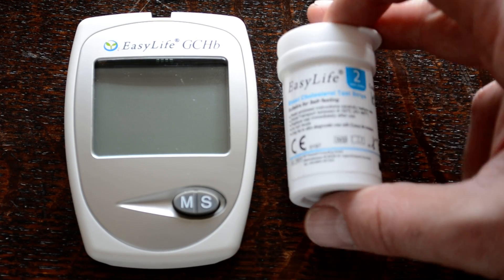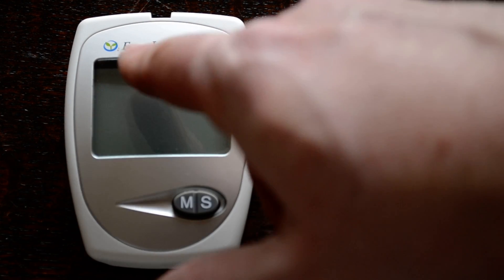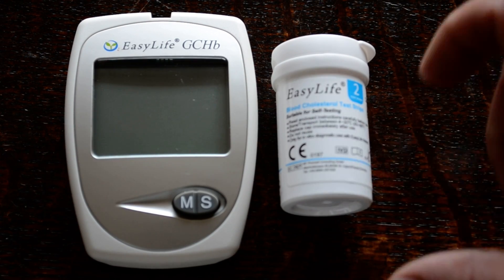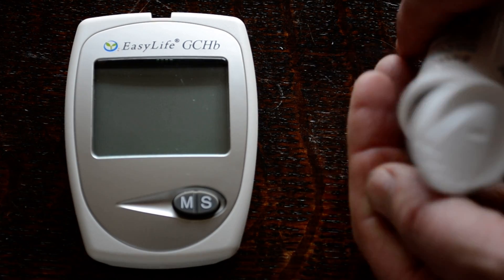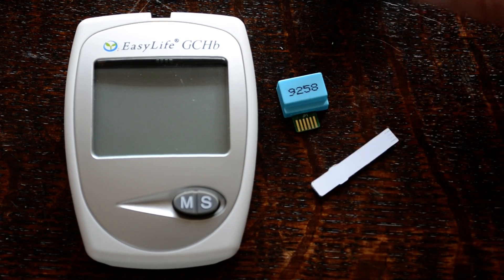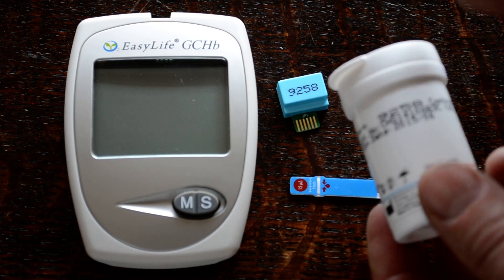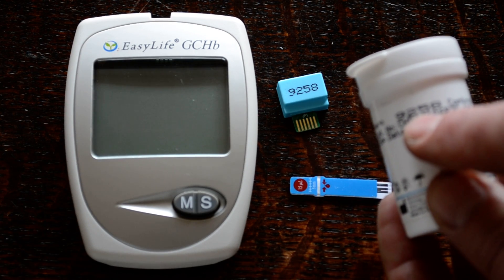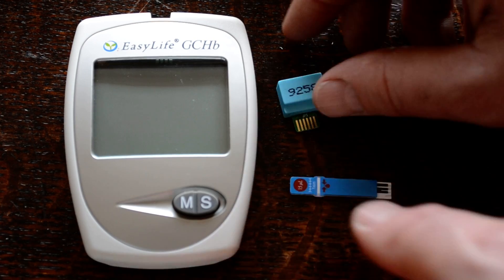When you buy one of these meters you get a starter pack of test strips — Easy Life cholesterol test strips for the Easy Life meter. You get two supplied with the meter. What you get is a code chip and the test strips. The code chip has a four-digit reference number — 9258 in this case — and I want to show you what happens when we stick the code chip into the back of the meter to run the tests.